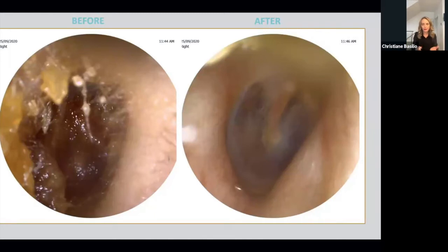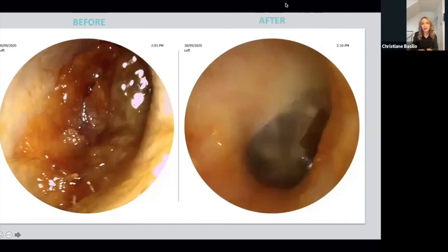What we've been noticing is: if you think it's the small size, use the medium; if you think medium, use the large. You want to make sure the tool is englobing the wax so that in just one try you get everything out. When you use something smaller, you might need to go back in. The great outcome from that case was the look of the eardrum — the ear canal was super healthy, wasn't red, and it wasn't too sensitive for me to perform the real-ear measurement and fit the hearing aids the same day. I was quite impressed.